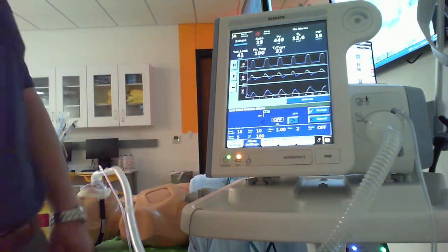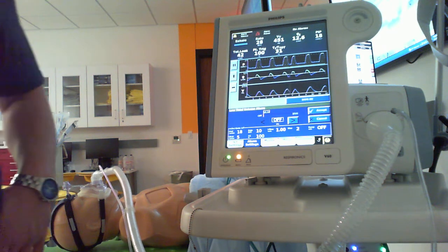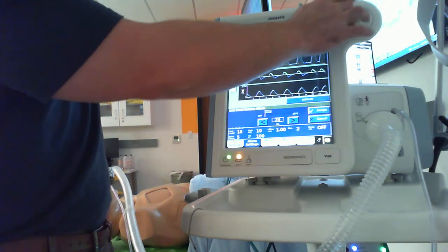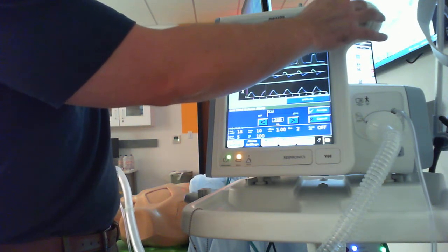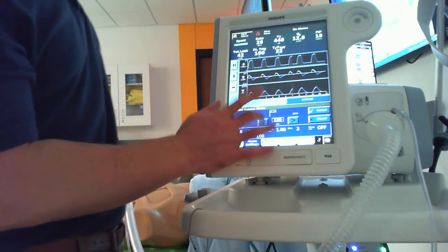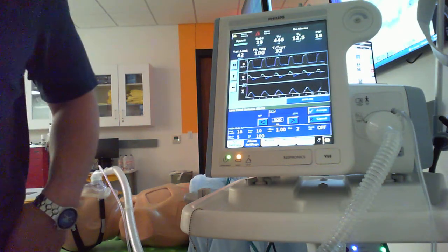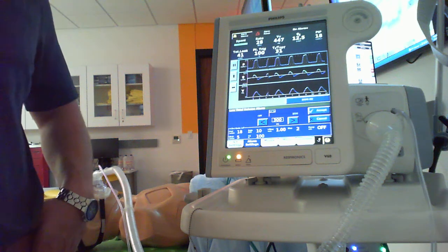Low tidal volume should never be off, okay? I like to generically set this at the lower range of what you'd like your patient to achieve. For most adult patients, us not wanting them to get less than 300 mils would be pretty good. All right. You could also use their 4 mil per kilo tidal volume, but honestly, during initiation, 4 mil is pretty low and not going to be super effective at unloading the respiratory work of breathing, improving alveolar ventilation substantially. All right.